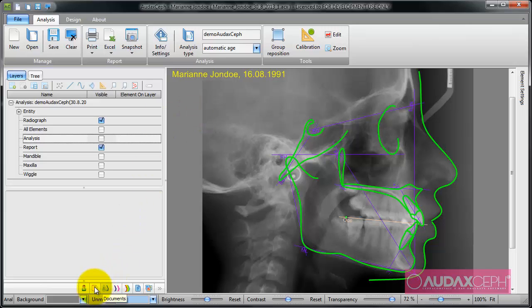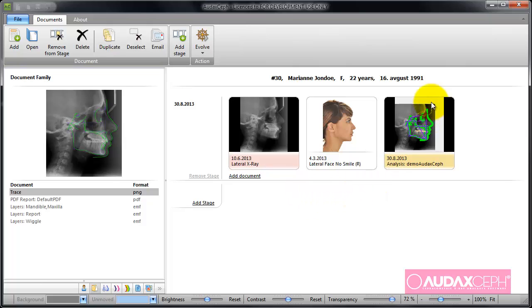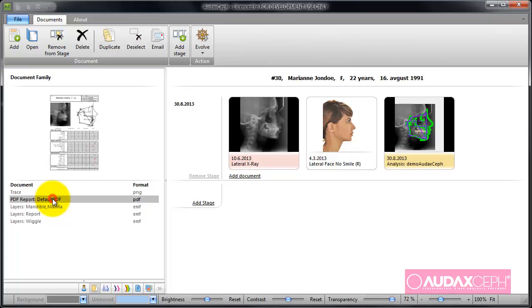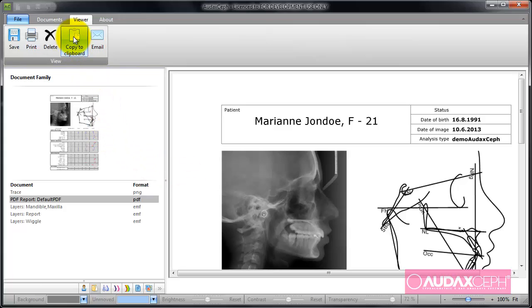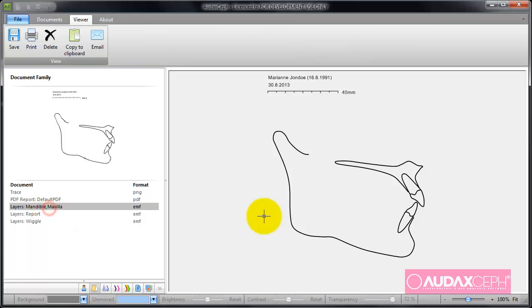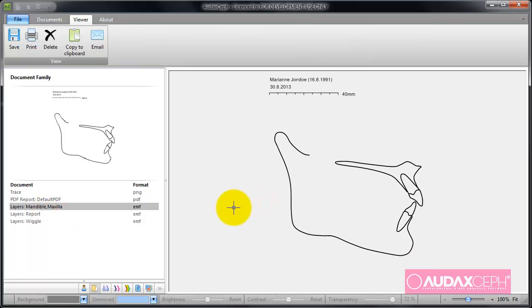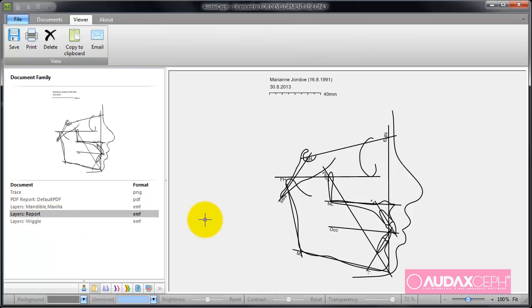If I go back to documents, you can see that a new document has been created — it is an analysis of this lateral x-ray, and this is the analysis type used. We have some documents attached to this analysis: one is a tracing image, another is a PDF report which can be copied to clipboard, sent by email, or printed out. There are also some silhouettes here, and these are exactly the documents predefined in the analysis type.